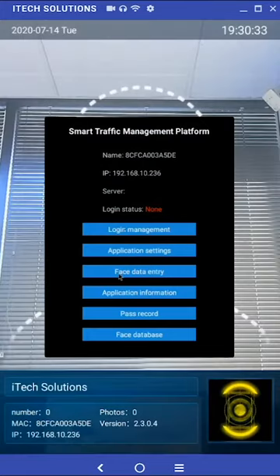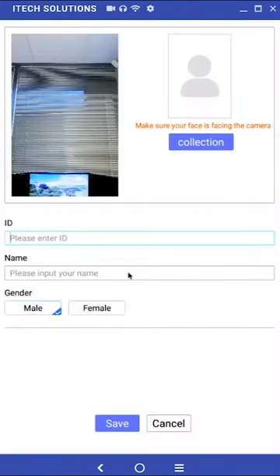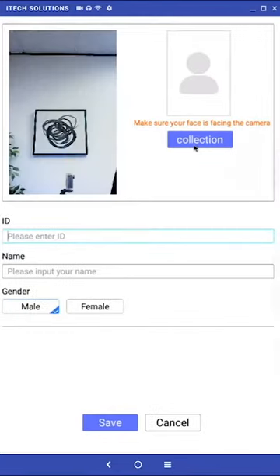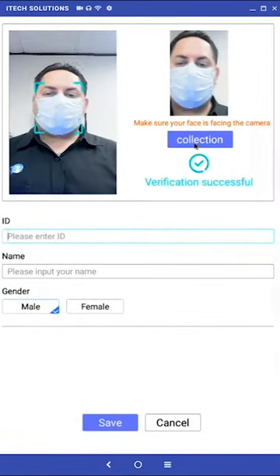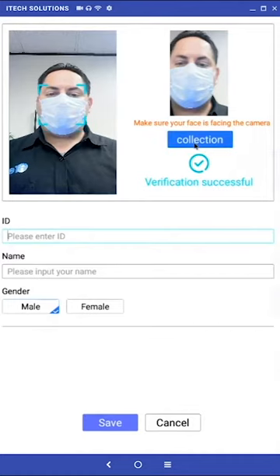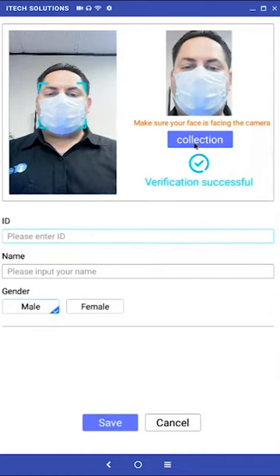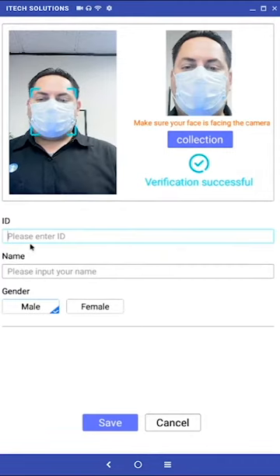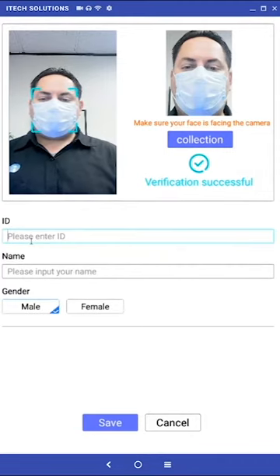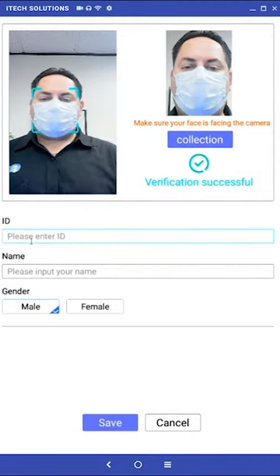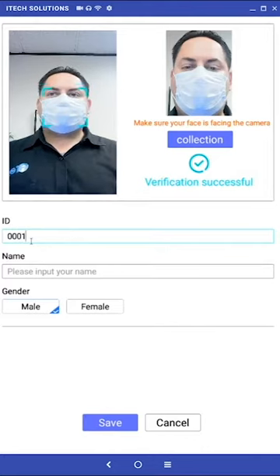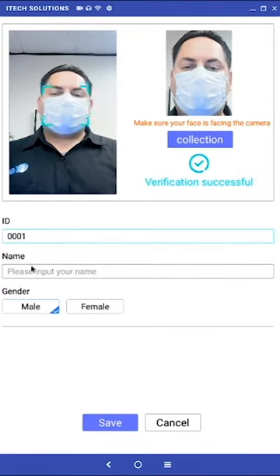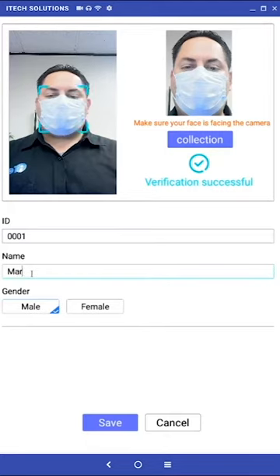Face data entry is where users can be added to the face database. To add a user, have them walk up to the unit until a blue square appears around their face. Click on collection to snap a picture. Below the capture there is an ID field along with name and gender. For ID we are going to enter 0001. Choose your own entry and enter the user's name.